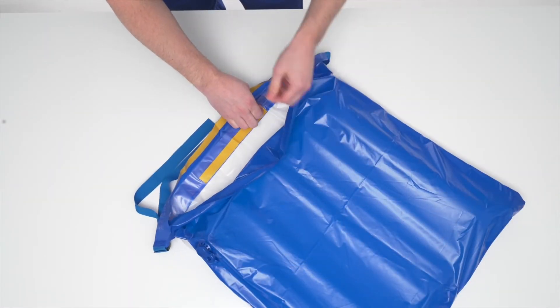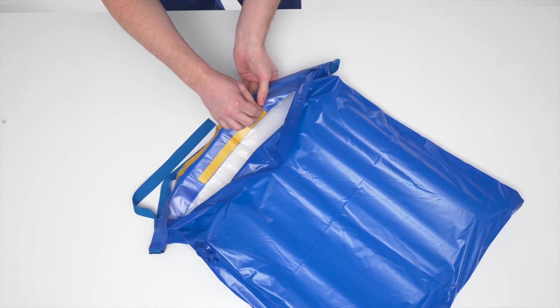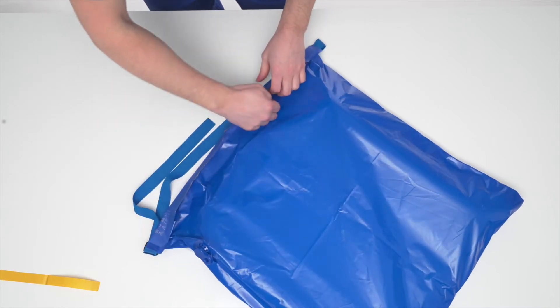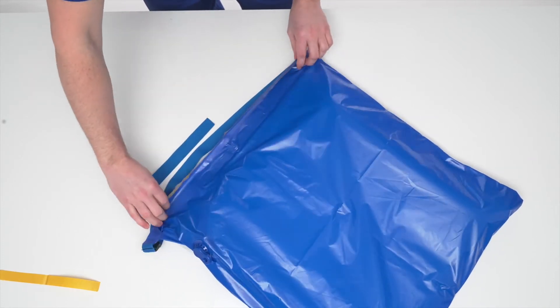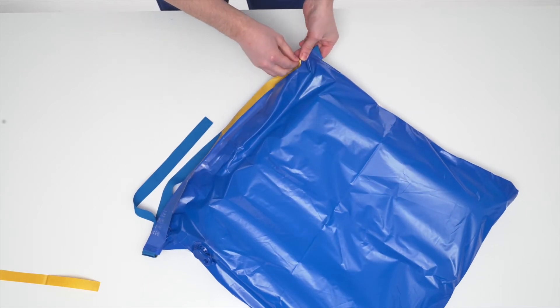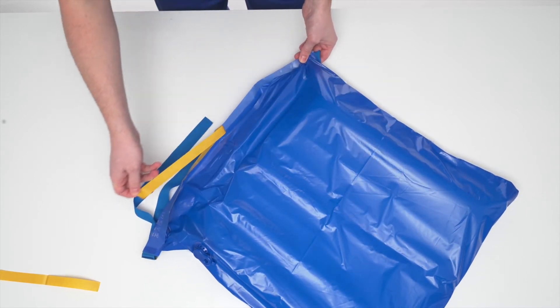Remove the inner peel and seal tape. Affix the cover to the adhesive tape and press firmly. Repeat the process, removing the outer peel and seal tape across the blue edging tape.